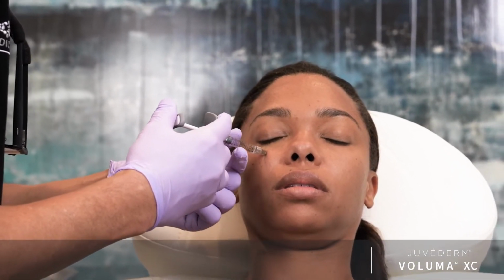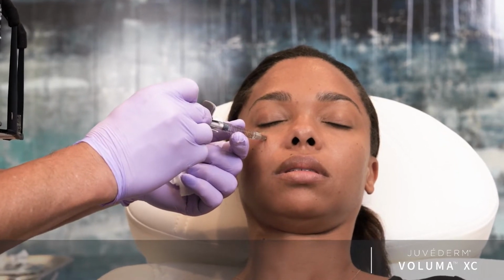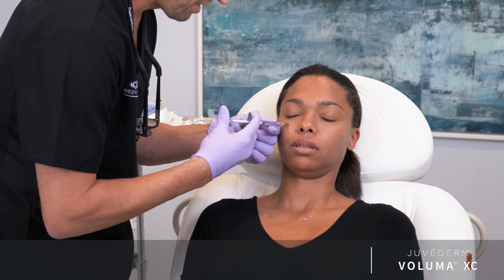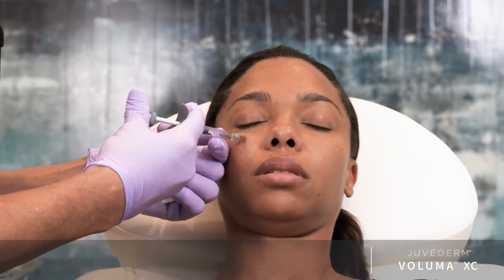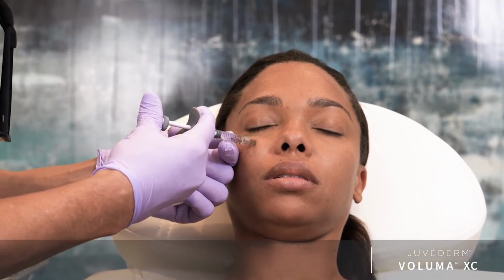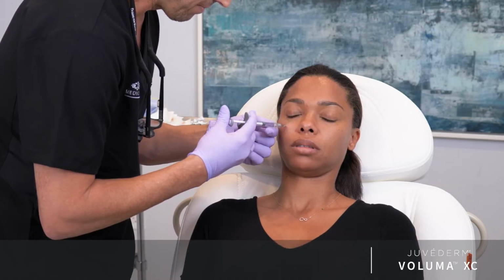Do you feel a tickling sensation in the lip, nose, or cheek? No. I'm against the bone. I aspirate and I inject again. Do you feel a tickling sensation in the lip, nose, or cheek? No. My frequent asking Talisha of that question allows me to get a sense of how close I am to the infraorbital nerve and the infraorbital neurovascular bundle. And that's a total of 0.2 cc's in that entry point there.